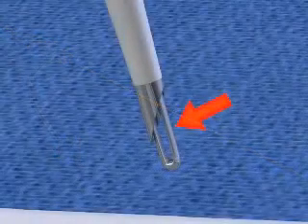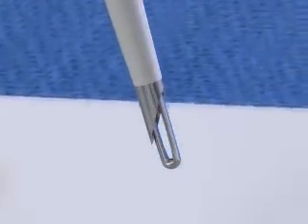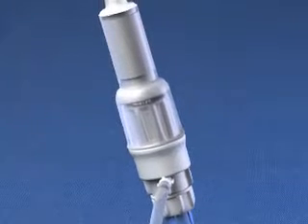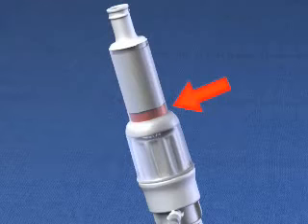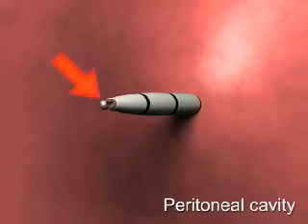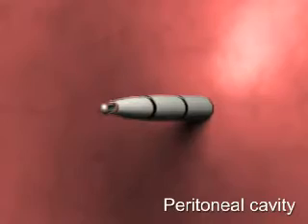This device has a safety mechanism with a retractable blunt obturator. When pressure is applied to the distal end of the device, the obturator retracts and the bevel of the needle is exposed, allowing penetration of the tissues. An indicator at the top of the device will turn red whenever the obturator is retracted. Once the peritoneal cavity is entered, the obturator redeploys. This safety mechanism theoretically reduces the risk of organ injury.